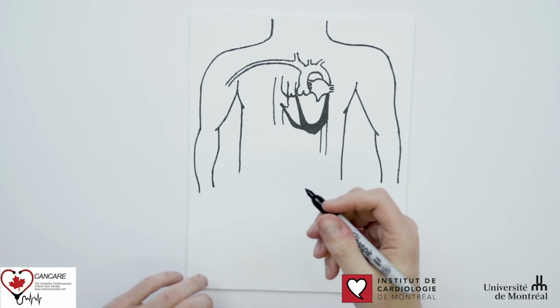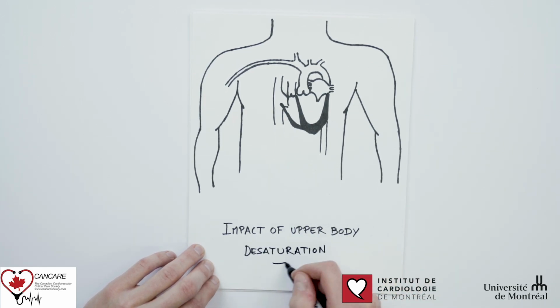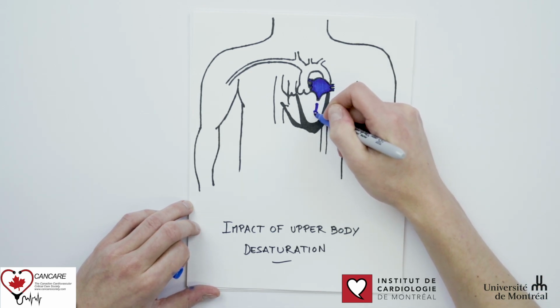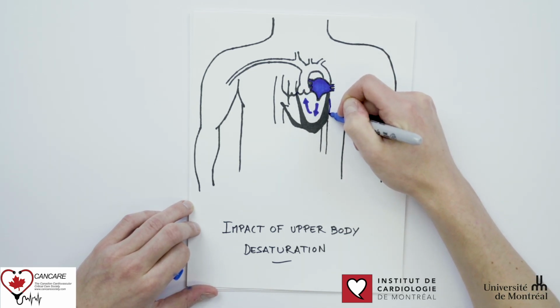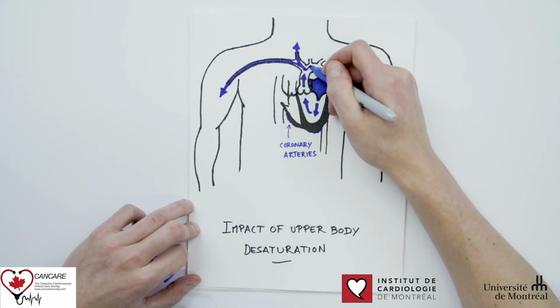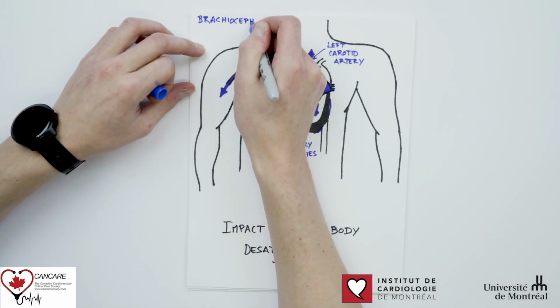Now that we've exposed the mechanism and physiology of differential hypoxemia, let's discuss its impact. Although ejection from the left ventricle is a sign of cardiac recovery, it can lead to organ hypoxia if differential hypoxemia is left unrecognized. In fact, as previously demonstrated, deoxygenated blood is pumped in the ascending aorta and feeds into the coronary arteries, the brachiocephalic trunk, the carotid artery, and potentially further down the aorta.